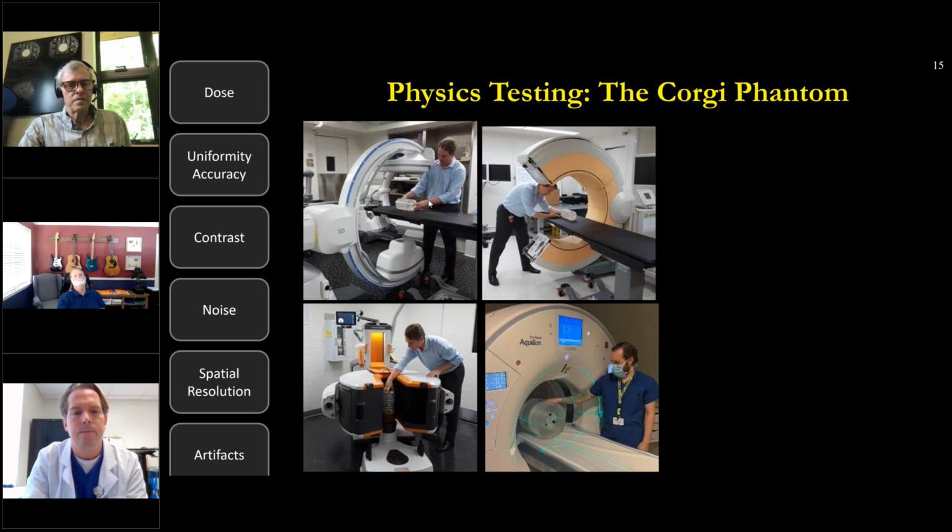Can I make a measurement on the Corgi phantom that would allow me to determine that a patient who was scanned on a cone beam CT scanner who had the exact same amount of dose actually did have that same 6 millisieverts, or would that be apples and oranges? Can one generalize the actual dose to a patient in a manner that would allow one to directly compare whole body CT in comparison to cone beam?